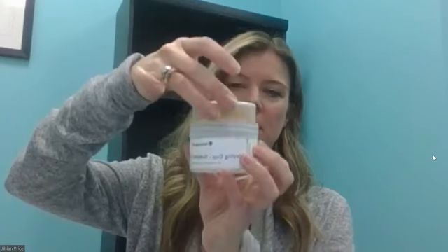Okay, so for putting it back in, you want the beads facing down. You want to put your foam pad on top. And then you just put the lid on.